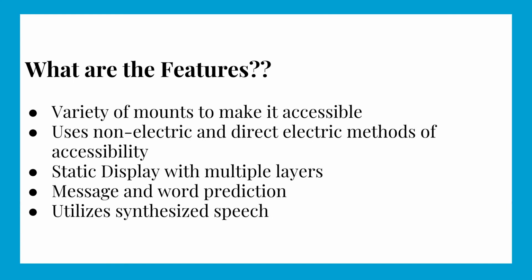Because I remember I was watching this video about the woman who is the voice for Siri, and she was talking about how she went in for months to do Siri's voice. And to me, it seems like Siri doesn't actually say that many different things. I mean, she does, like names and things like that, but I don't know. I feel like if I use synthesized speech, there could be a lot more words that the user could use, and I just thought it would be a better overall speech for this device.